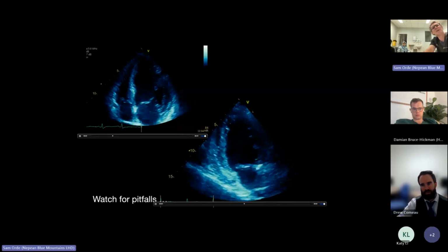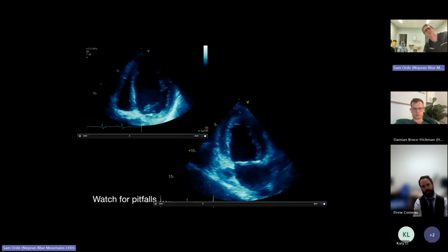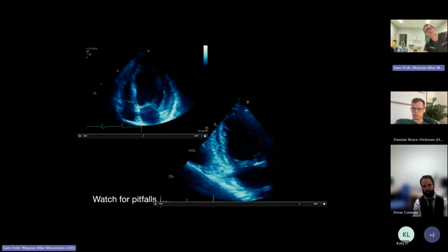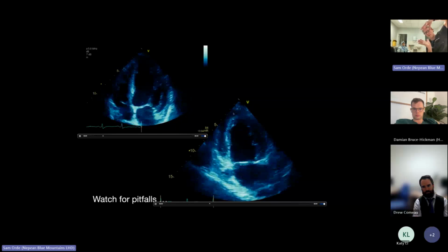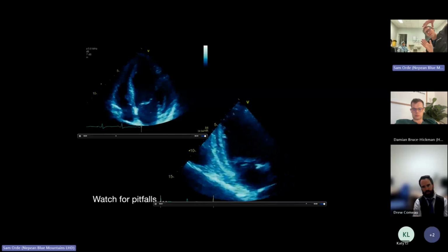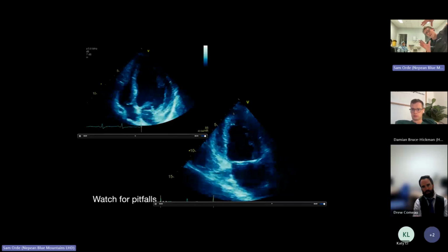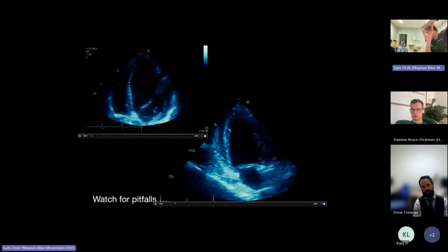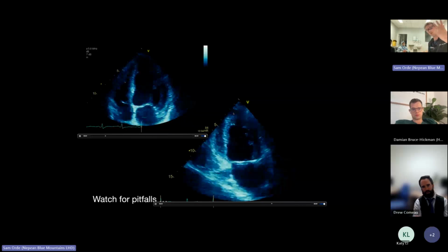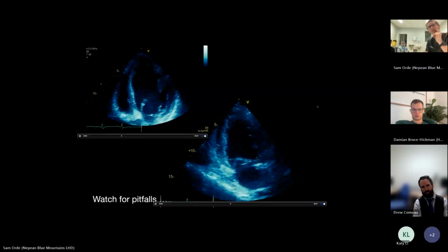Yeah, really nice. One of my little tips and tricks is to put my thumb right on top of the picture. I'll try and do that with my cursor, can you see it okay? I've put something at the top of the image. Remember that if that's the apex of the heart and that's the base, the base moves towards the apex, in a bit of a twisting format. But the apex stays fixed, at the apex and at the pulmonary veins, sort of the back of the heart. Imagine the annulus or fibrous skeleton is the bit that moves up and down. So the apex should remain fixed, and if you see the apex moving, it tells you that you're off axis. It should remain fixed. Nice.